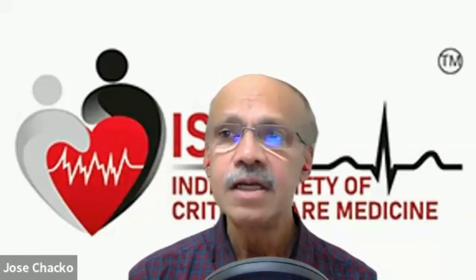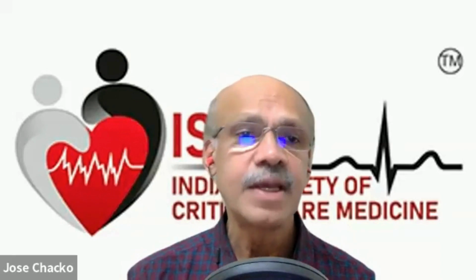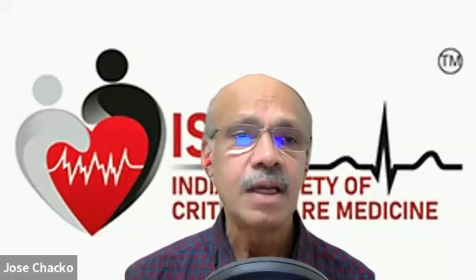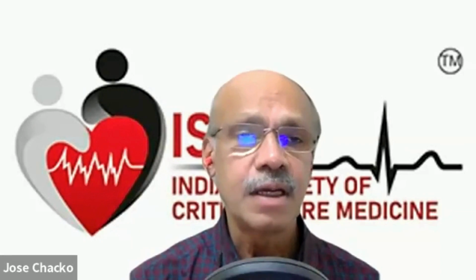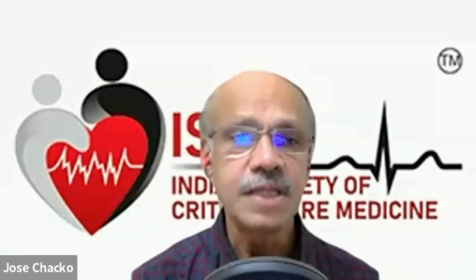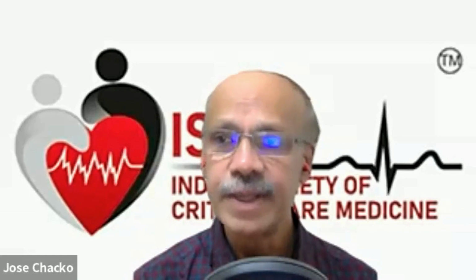Just eyeballing should suffice under most clinical circumstances to look at the overall LV function without having to estimate the precise ejection fraction.